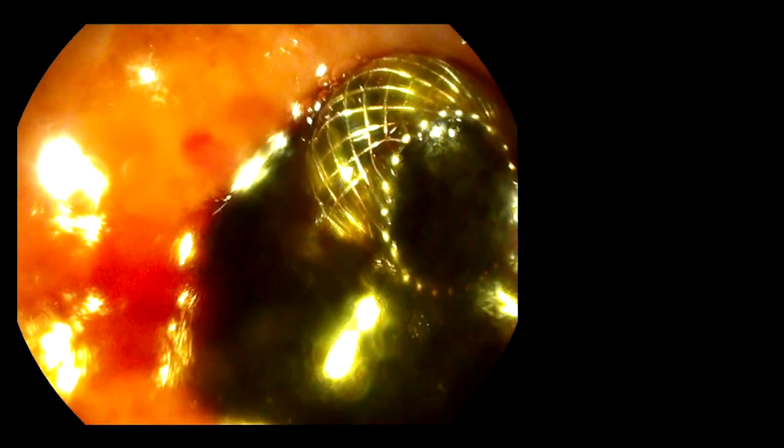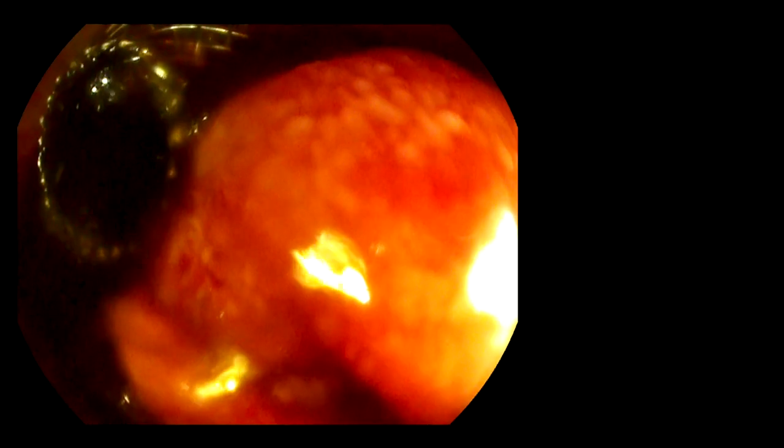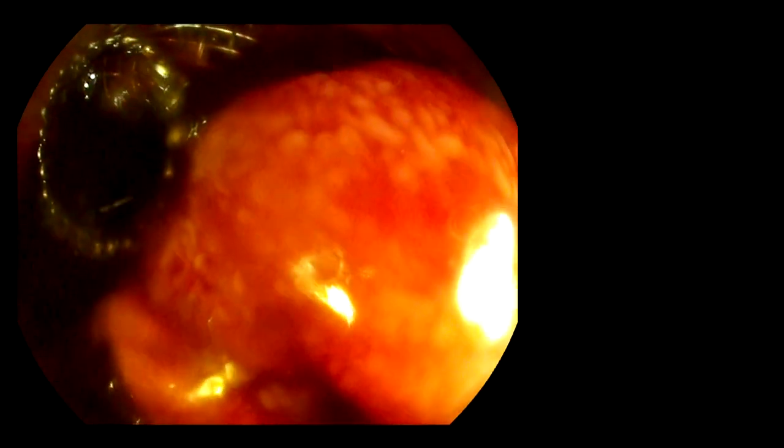After EUS-guided choledochoduodenostomy, an EUS-guided gastrojejunostomy was performed. The choledochoduodenostomy was performed first in order to minimize the risk of stent dislodgement in the gastric lumen.